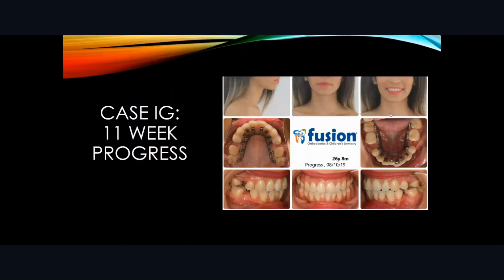This is one of the things you have to discuss with your patients when you start the case, because if you have a good level of alignment at the beginning, you either request that to maybe maintain during the treatment planning session, or otherwise you should expect that initial perfect alignment to be disrupted for a short term until the teeth basically reach their final destination.